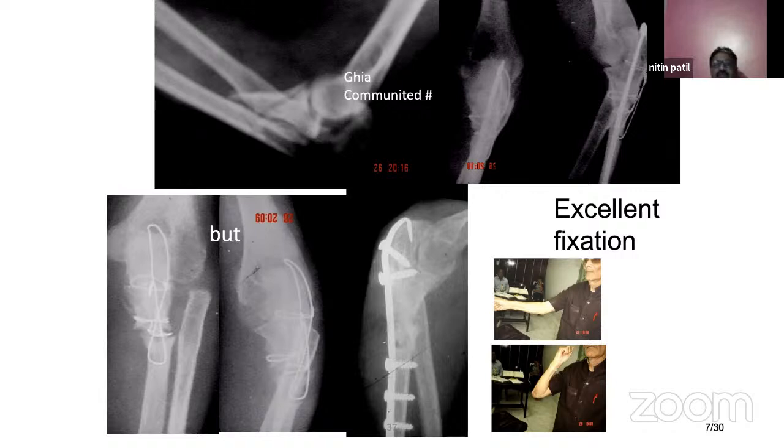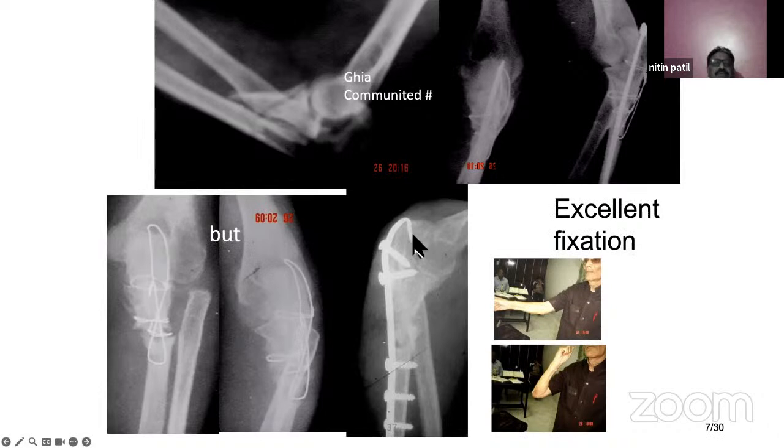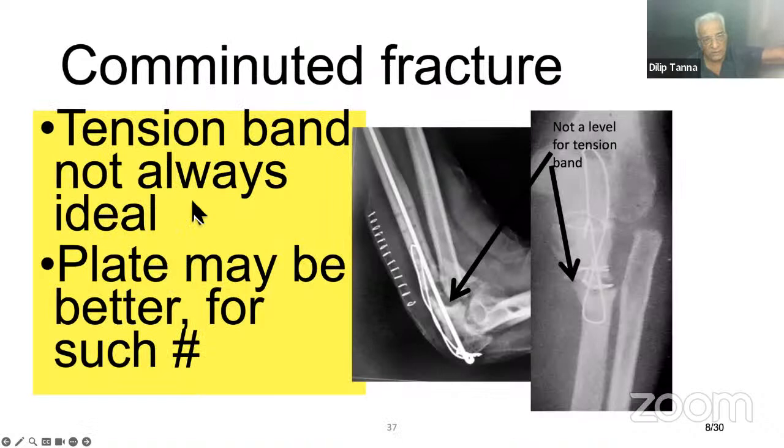So this hook plate was done, and as you can see, the whole thing was reconstructed, and this is the range of movement the patient got even after this sort of a non-union. Such a fracture, tension band is contraindicated. It has to be a plate, some sort of a plate. This is the hook plate which I had long back when the AO hook plate was not available. This is the one I had designed at that time. And you can see here is a comminuted fracture.